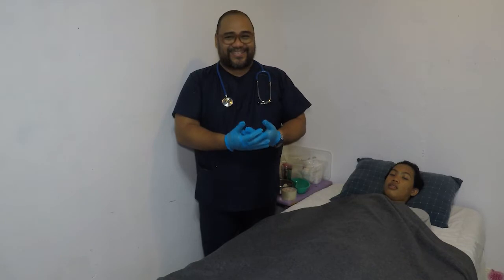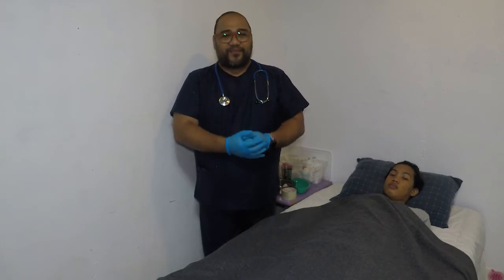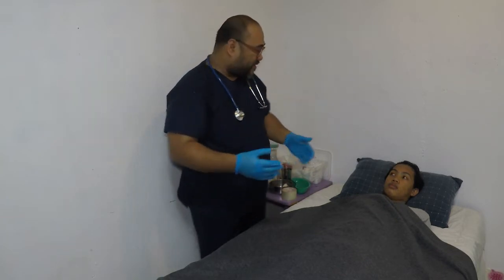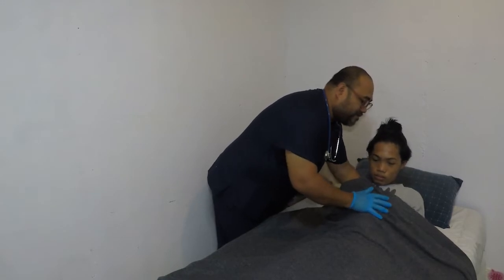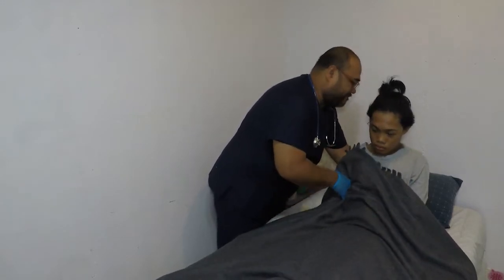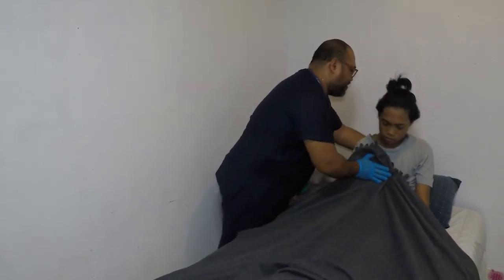Perform hand hygiene. Wearing disposable gloves is necessary, or if available. This is to prevent the spread of microorganisms, but sterile technique is not needed because the digestive tract is not sterile. So we also have to assess the client to high Fowler's position or 45 degrees. If unable to maintain an upright position, more natural for swallowing. Sir, okay? I'll be positioning you. Let's adjust your body. Help yourself. Move. More.